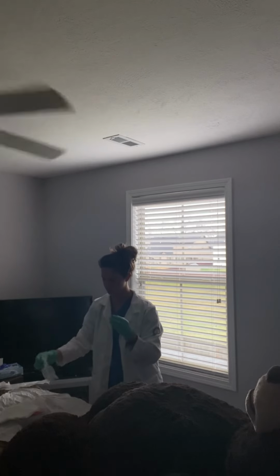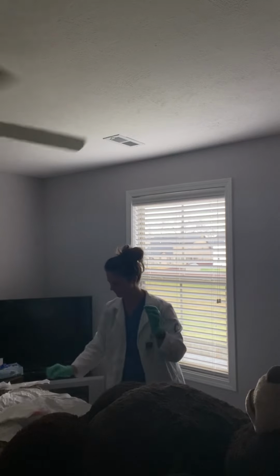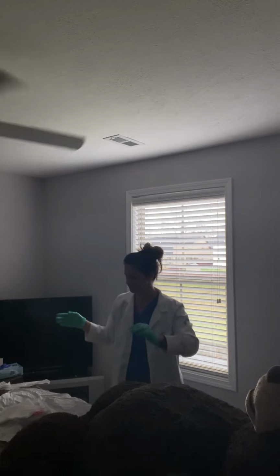Gonna take my other one here and swipe the outer side. Trash. And wipe the outer edge. 1 stroke each gauze.